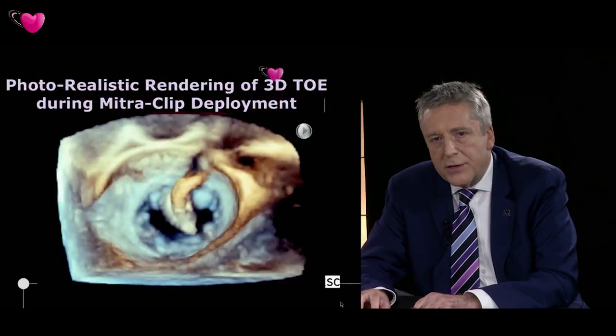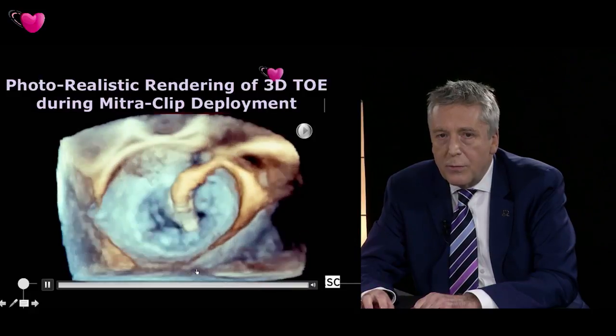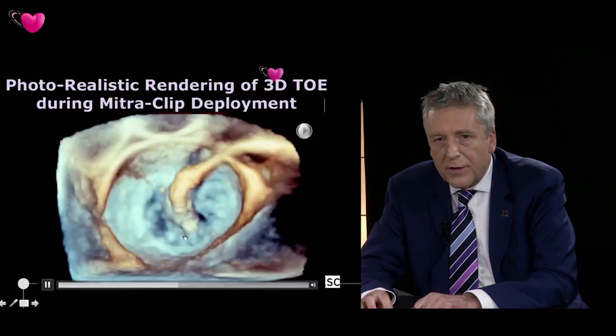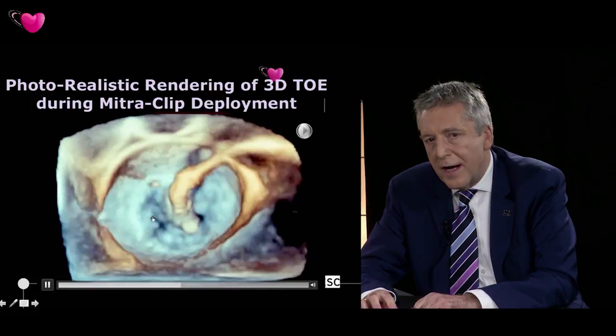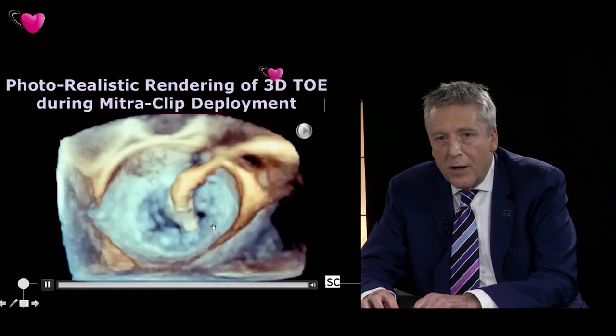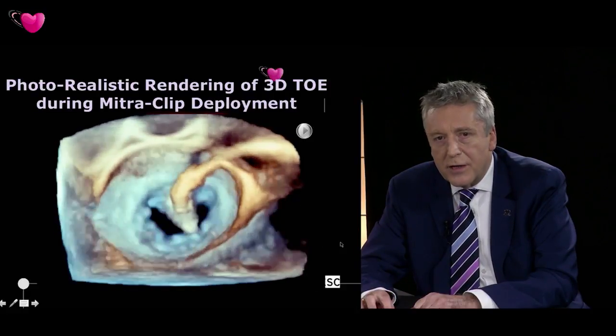is a patient who's undergoing a mitral clip procedure. And as you all know, one of the crucial parts of this procedure is to make sure that the clip arms are perpendicular to the coaptation line of the mitral valve. And that can vary depending upon which part of the mitral valve you want to deploy the clip in. And sometimes that can be quite difficult to visualize.